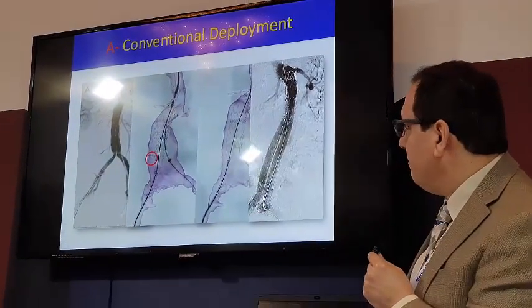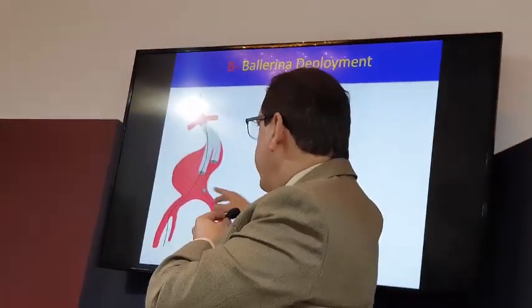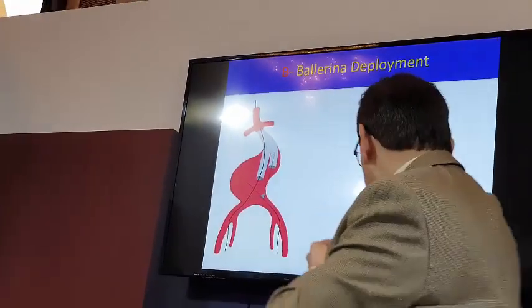But if you have, let's see another, if you have angulation in the iliac, where the wires cross each other at 90 or 45 degrees or more, like that.